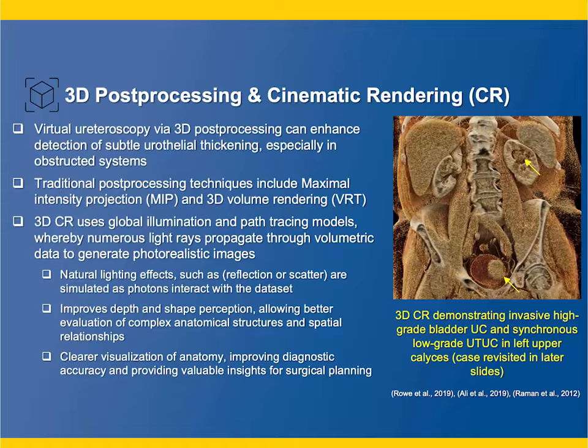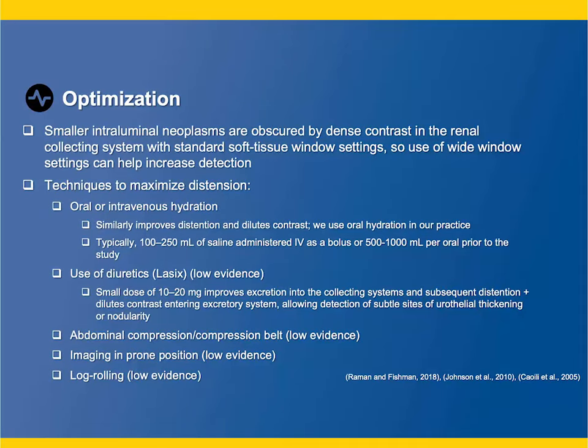That is having a lot of preset values, so you don't need to spend a lot of time. I could do a cinematic rendering of a kidney in multiple phases in well under 5 minutes. So it's not really that time intensive, but it does take more time, and all of us are very busy.